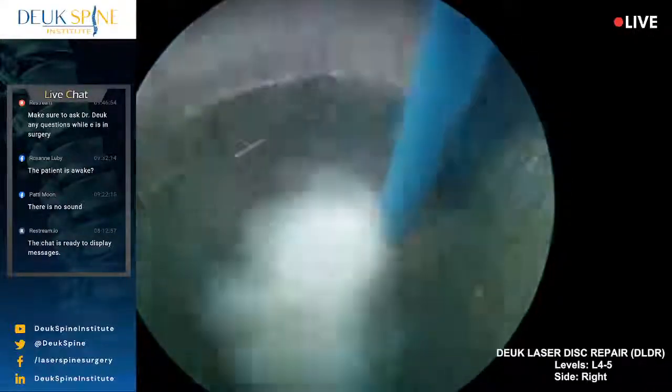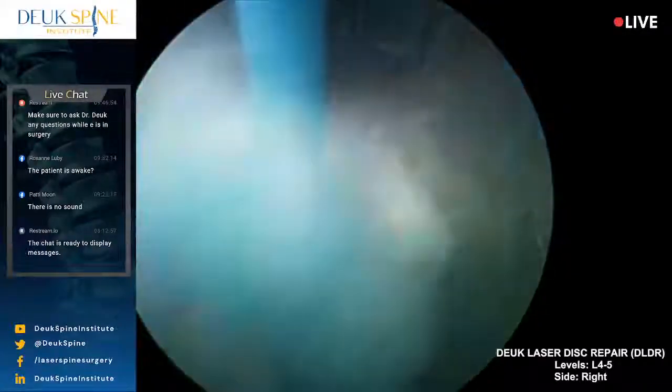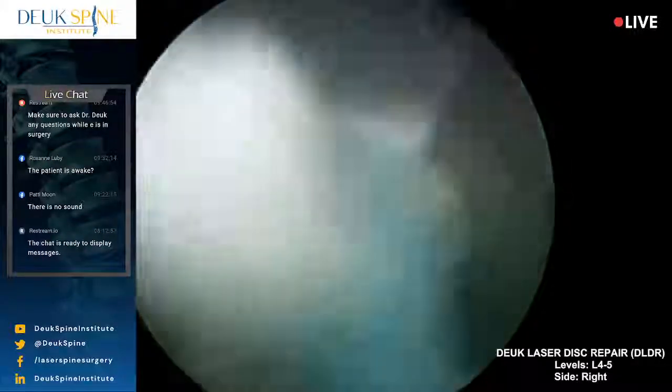Any questions from our audience? He's going to start feeling this. I cannot move this for some reason. Just give me a heads up when you're close to where it's very sensitive, and I will give a little more for that part.